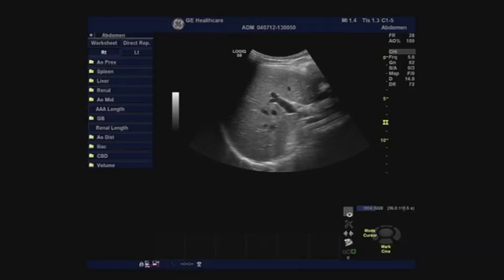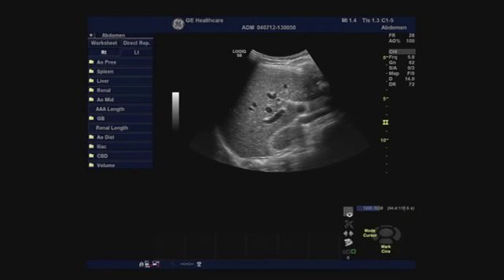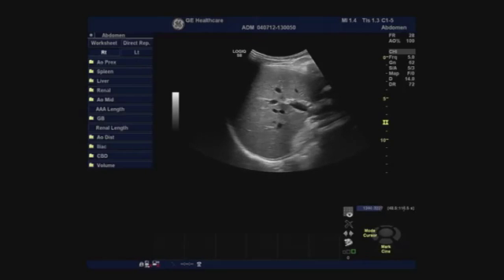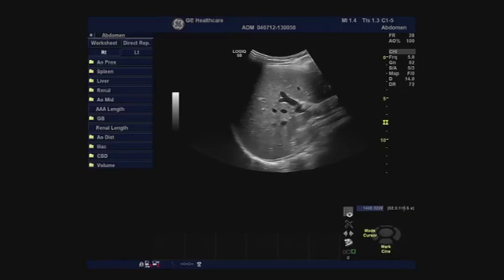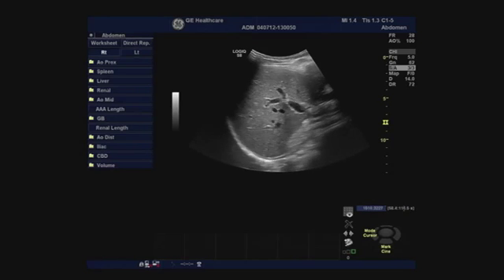I've brought in all the speckle within the image, and it's not as aesthetically pleasing as it was at 3. If I go to the other extreme, which is 5, you can see that this is too much smoothing. It's beautiful for definition of boundaries and borders, but almost artificial looking. So I do prefer this middle of the road. 2 to 3 is ideal for day-to-day scanning.